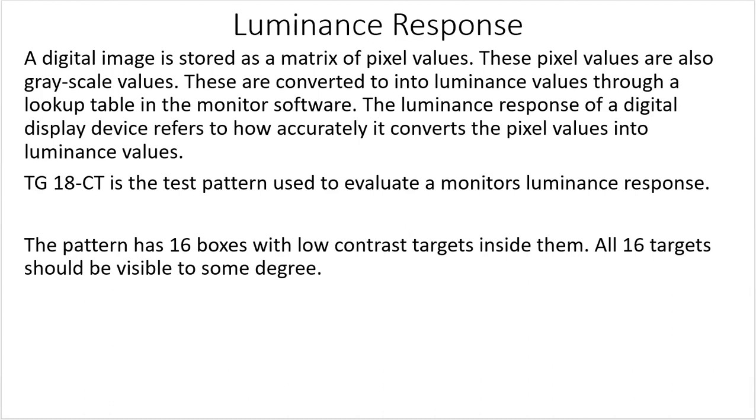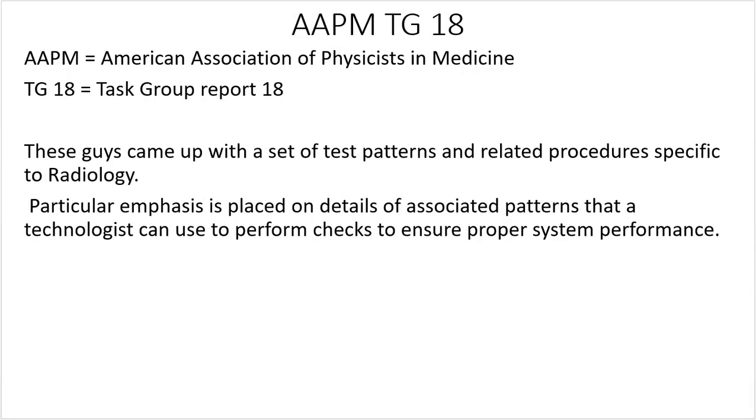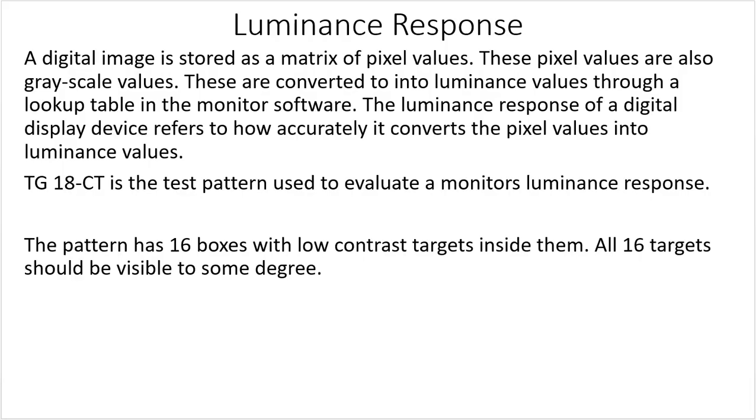TG18CT is the test pattern used to evaluate a monitor's luminance response. Now remember, all these different test patterns come all the way back from these guys. Remember, Task Group 18 came up with all these crazy tools to test these things. So there's a whole bunch of them. We're going to use TG18CT as the test pattern used to evaluate a monitor's luminance response.